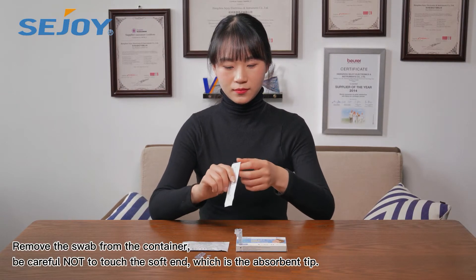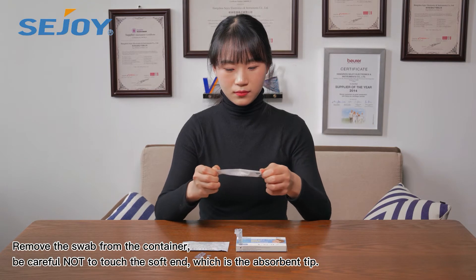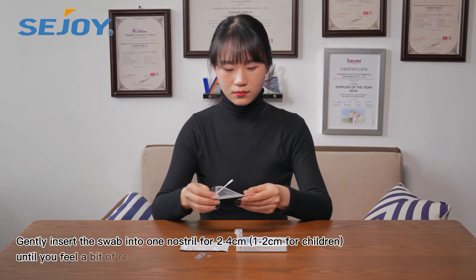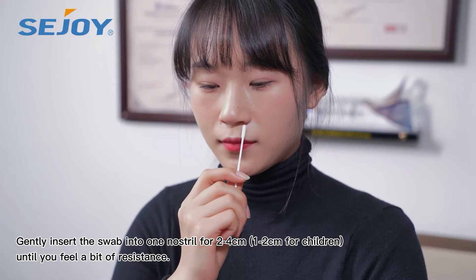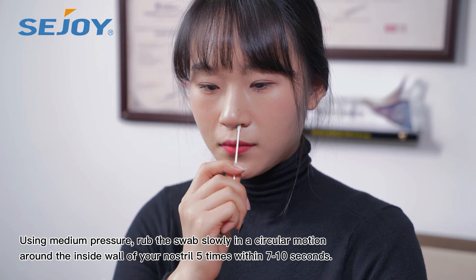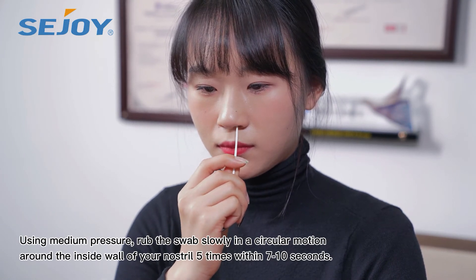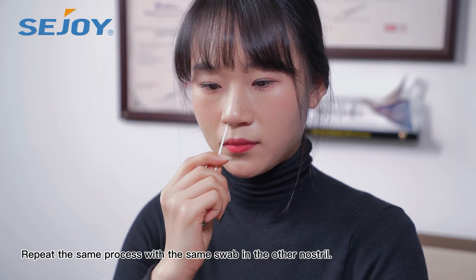Remove the swab from the container. Be careful not to touch the soft end, which is the absorption tip. Insert the swab into one nostril for 2–4 cm. Rub the swab slowly in a circular motion around the inside wall of your nostril 5 times. Repeat the same process with the same swab in the other nostril.